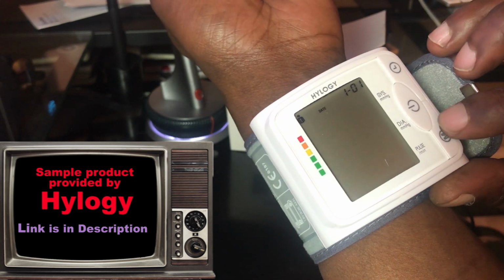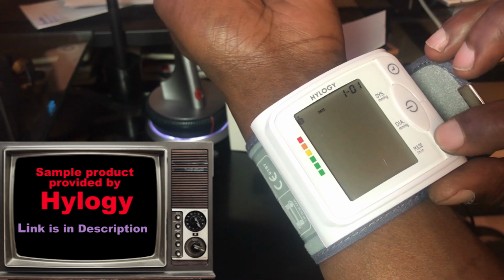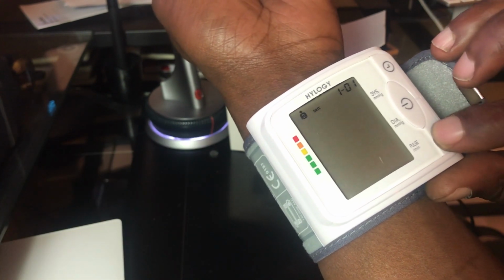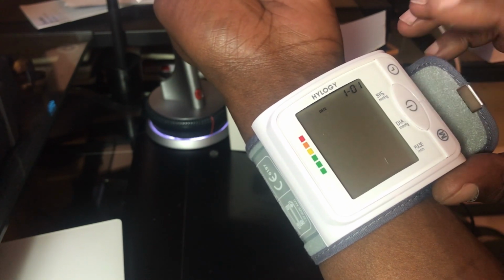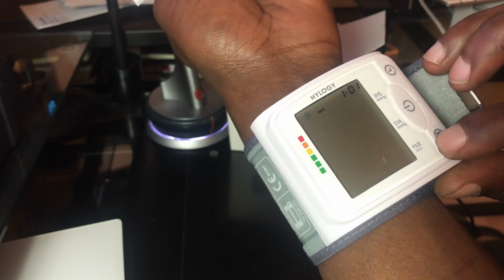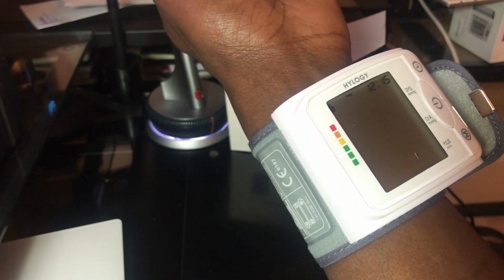Then you go to your memory. If you're user 1, then you can go ahead and press the power button. But if you're user 2, you press the memory, and then it switches to user 2, and then you press the power button. But I'm gonna leave it at user 1 and then press the power button. Alright, so that's how you change the user.